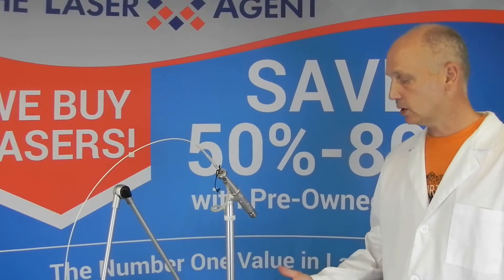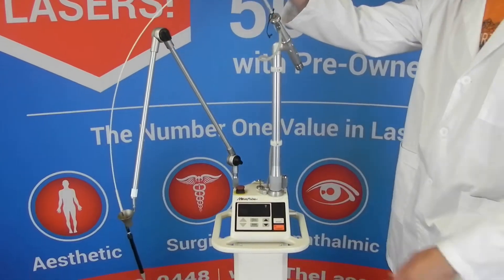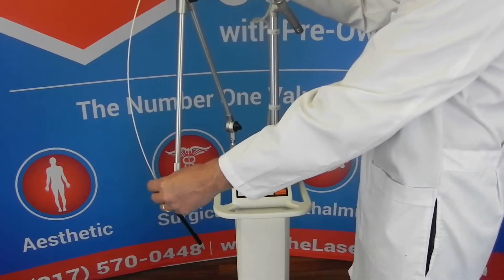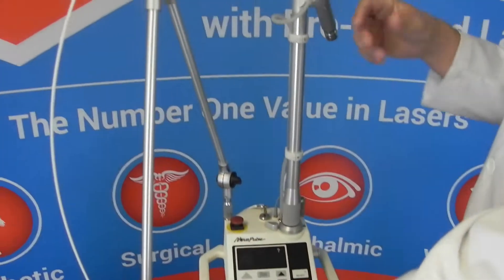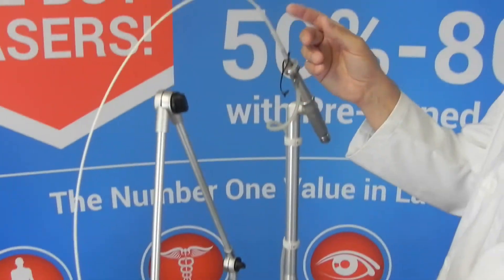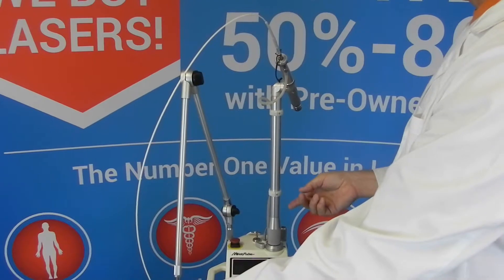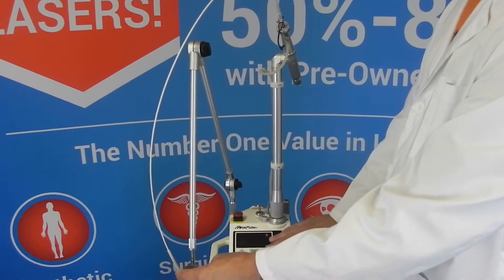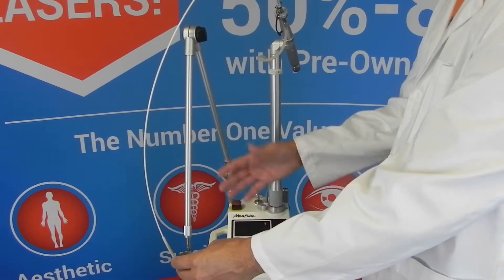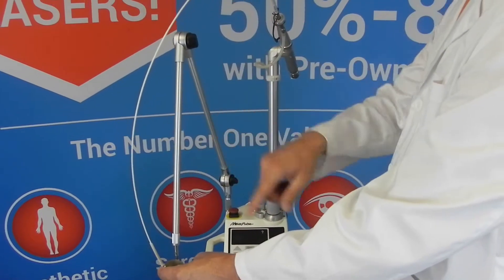Hi, this is Tony with The Laser Agent. Just a quick video to show you how to do a fiber verification or a calibration of your flexible waveguide. This is the hollow waveguide, flexible waveguide — some people call it a wand or a fiber. What you have to do per the operator's manual by the manufacturer is to calibrate this every so often to account for the energy loss coming out of the laser through the end of the tip, so that what you dial in on the control panel in watts is actually what is reaching the tissue, because you have to account for some loss in here.